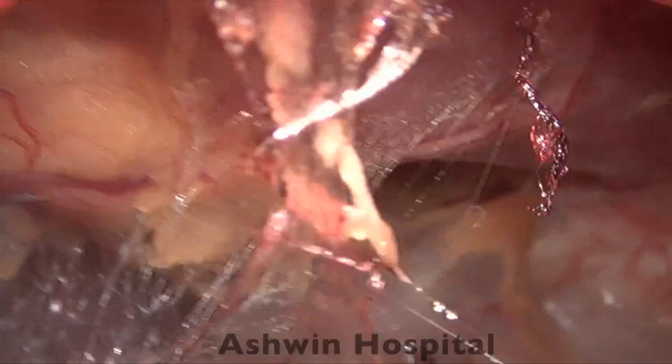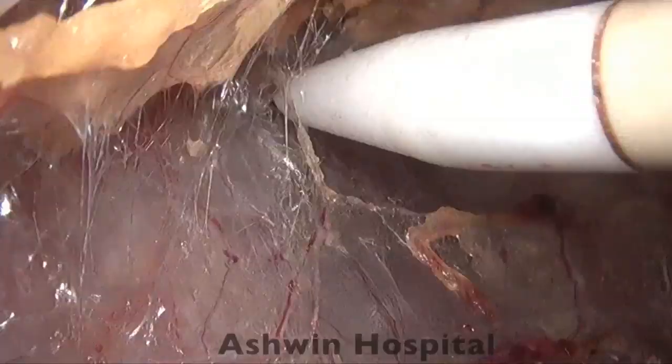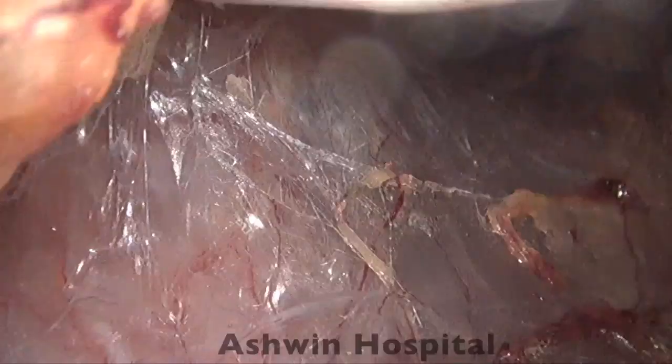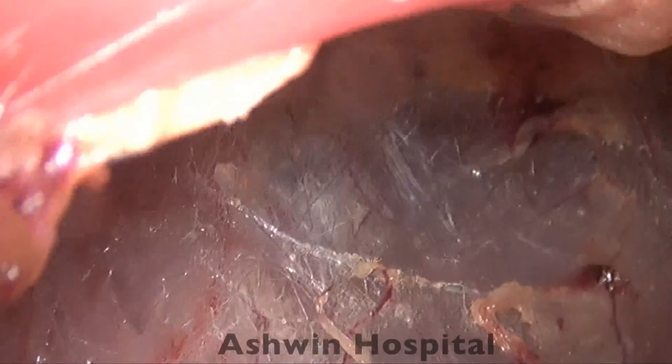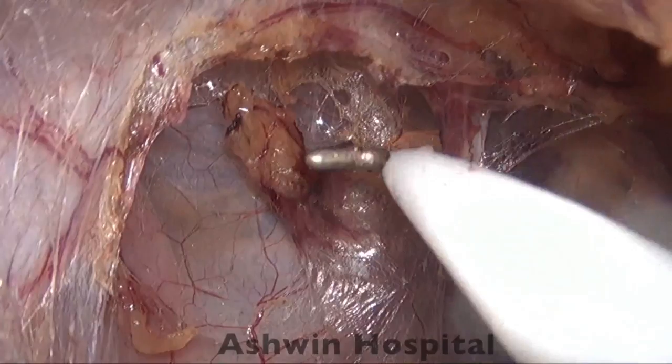So now that is the left retrorectus space, which is clearly visible. And here you can see we are trying to feel for the indentation and see if we are ready to make the second working port also under vision. So still some amount of this loose areolar tissue is left behind, and we are just trying to dissect it and open up the planes so that we can have a nice vision of where the port is going to come. Till this step, most of the time we work with a 0 degree only. Very rarely we might have to change to a 30 degree.